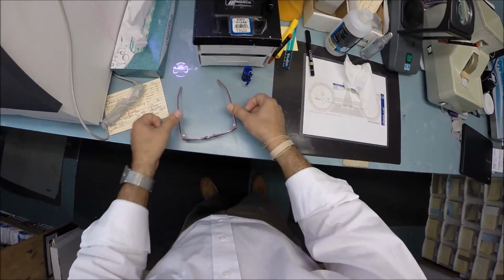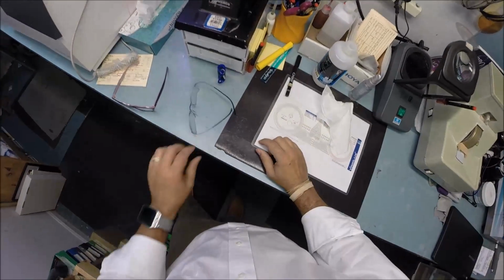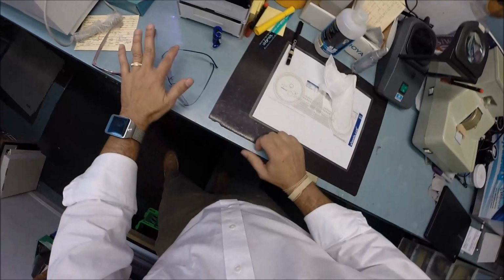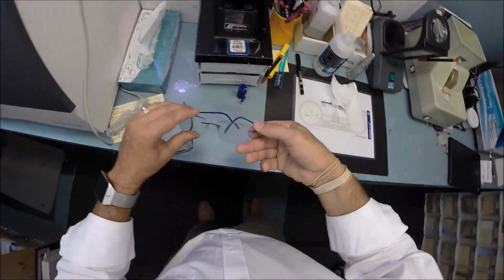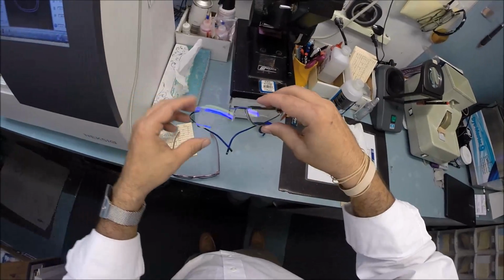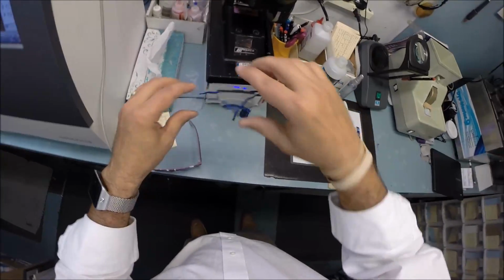All right, so press down on the counter. There is no wobble. I would show you mine, but these have so much wobble to them. Actually, you can see a little bit of it. You can see a little bit how one side is higher. I'm part of that 80%. Of course, these are my new silhouette drill mount. You see my little purple lenses there? Not the most masculine color, I got to tell you.